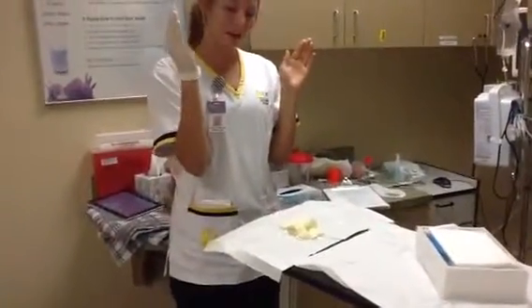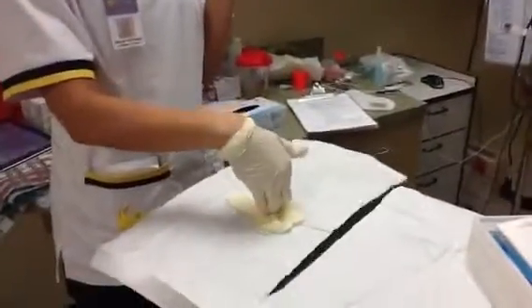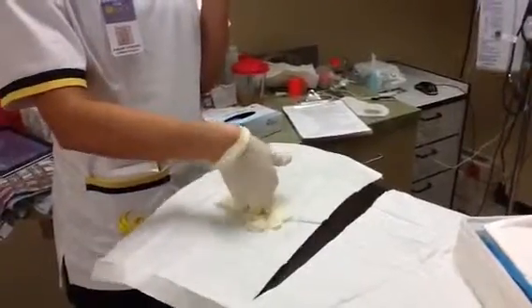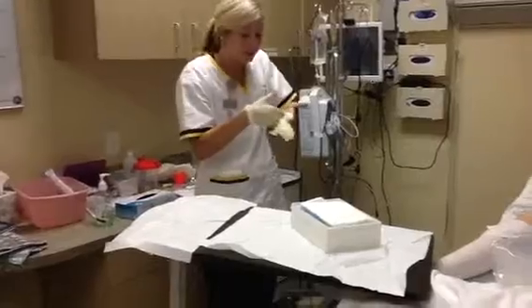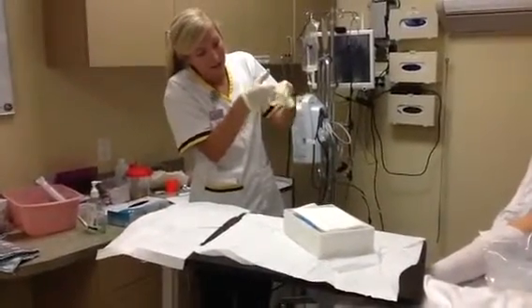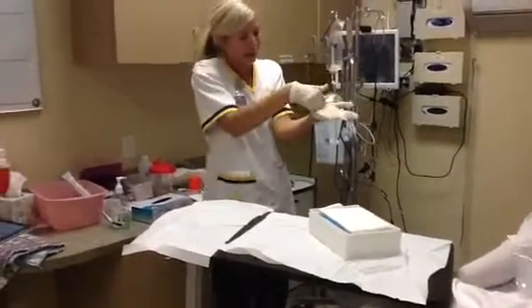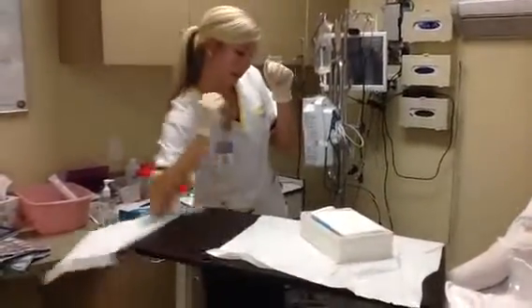Now to grab my left glove, I'm going to take my right hand and place only my 4 fingers underneath here. Again, step back, make sure that my hands are above my waist, and I'm going to stick my 4 fingers in there and supinate my hand. At least I get this correct. Into this glove. Once I have that in, I put my hands together, and I can get rid of this.